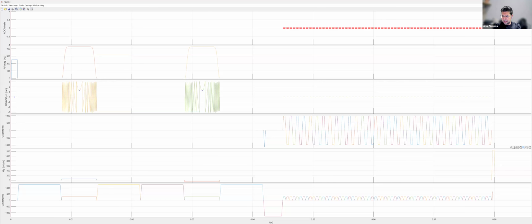And you said the surgery examples are in TSC and Trufi, so I can look there how to cut the gradients. Right? Yeah. Another, I think, Semi Laser also has a quite advanced gradient surgery, so you can see how it's done. But like I said, your example is so much simpler, so you can create the gradient which you need, just because you know what you're doing.